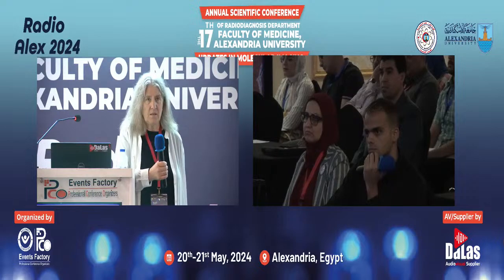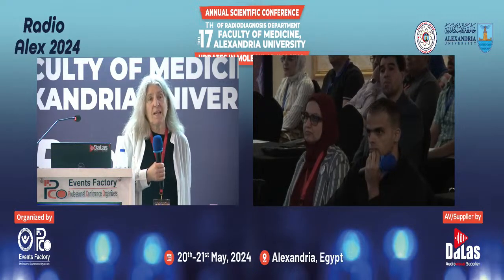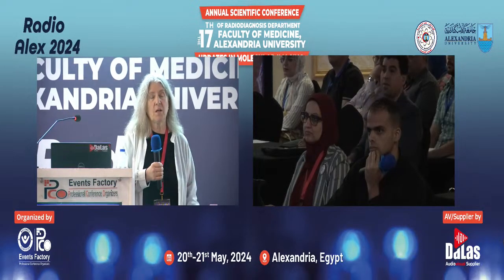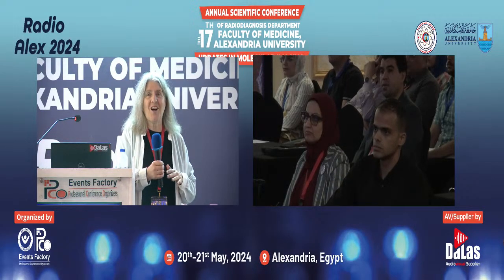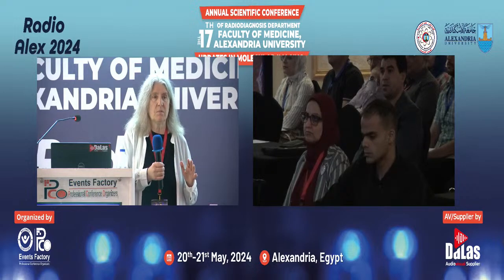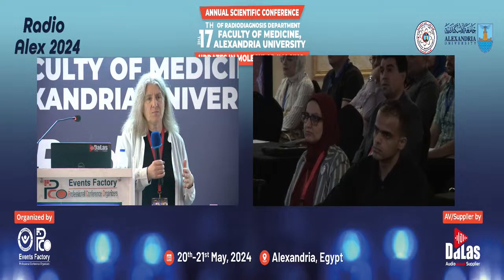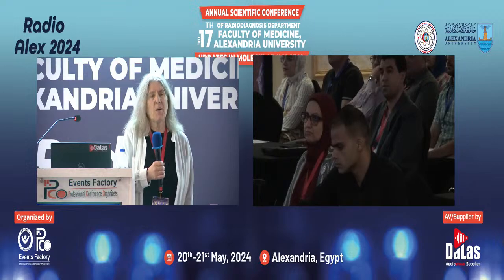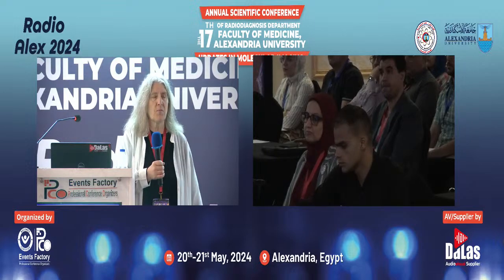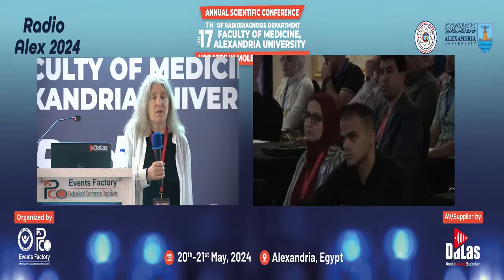Well, there is respiratory gating that is possible with PET-CT to reduce the respiratory motion, but in general, respiration is not a horrible problem. Any motion with MRI really degrades your images, but a little bit of motion with PET is not a big problem. But it is possible to do respiratory gating. The problem with respiratory gating is that it takes longer to do that study.